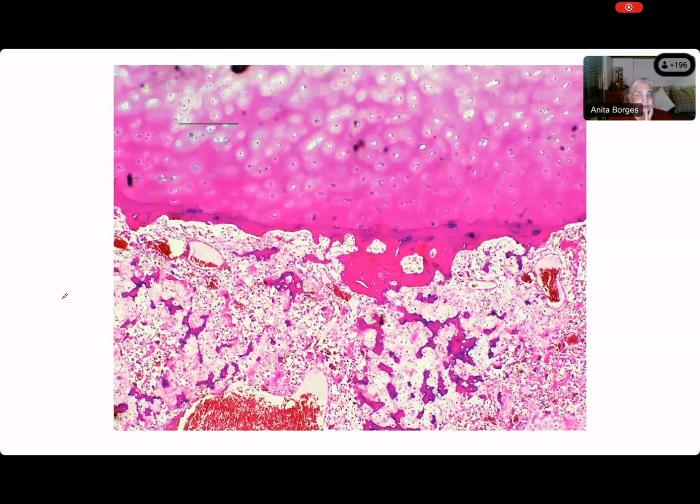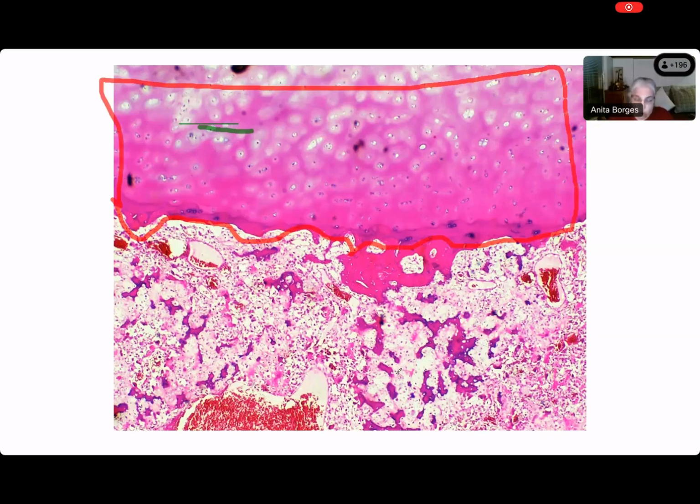This part, this whole part. Take a thicker pen. You see there's a pen over here? Yeah. Take that thick pen, you've taken a line. Take a pen and outline whatever you think is the cartilaginous tissue which you think is more. Okay? When I mean outline, shall I outline it for you? I think you mean this, right? Yes, ma'am. Yes. So all this from there to there, according to you, cartilaginous tissue is more. All right. So what do you think this cartilaginous tissue is, Sarangi?